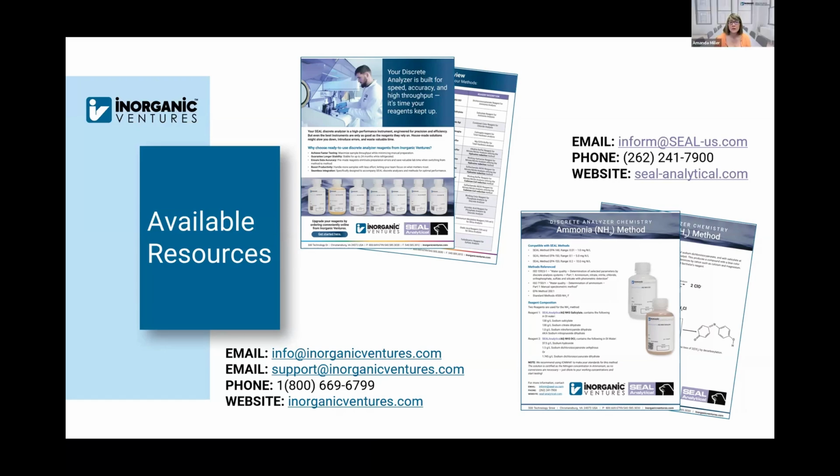Yeah, but we also don't want to scare you, right? If you've been running with making up the reagents in-house and you have them in the reagent container, we do supply closed caps on the system. The reagent tray does come out and goes into the refrigerator. That's all by design. So if you've been doing it that way with the reagents you've been making up in the lab, you can absolutely continue to do that with these reagents. When they come out of the bag, they magically don't all of a sudden stop working within 24 hours. So don't be worried about that. You can probably continue to use them as you have been with regards to storage. Just make sure that the rest of that bottle is still in that bag and sealed so that it isn't exposed to light.